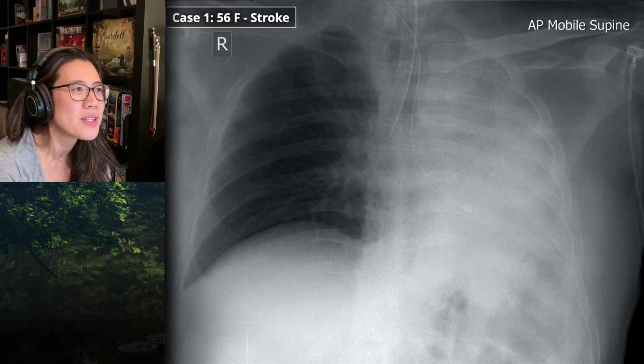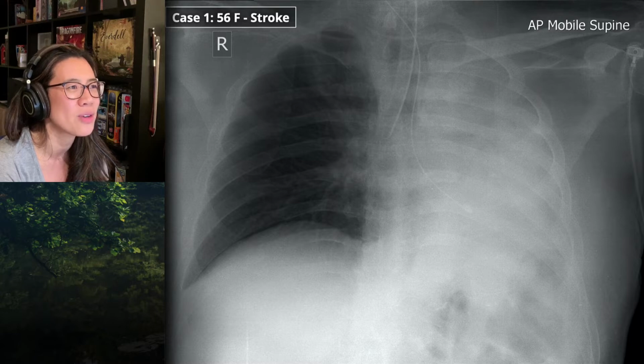Well, so that was in the upper chest. Yeah, I was going to say in the upper chest, it's not in the trachea. It's lateral to the trachea. That was odd. I did see that, and I thought higher than that, it goes to the right side of the pharynx. Correct. Yeah. Or the right side of the larynx, probably.